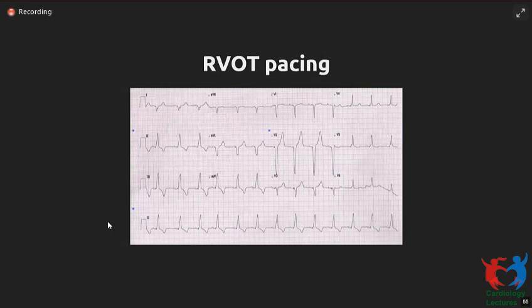With outflow tract pacing, you tend to get a nice, very narrow QRS in some of the patients. You can know this is outflow tract by seeing that the paced morphology is upright in the inferior leads. Even where you're not using the newer methods of conduction system pacing, you may still get a quite narrow QRS if you do septal pacing instead of apical pacing. Even though the evidence for clinical benefits from this is still not very robust, more and more we prefer to do this in almost all the patients.